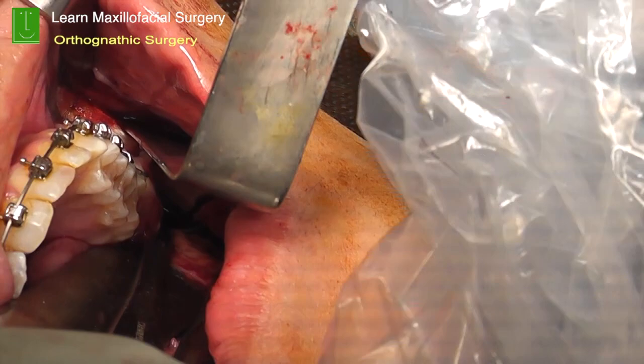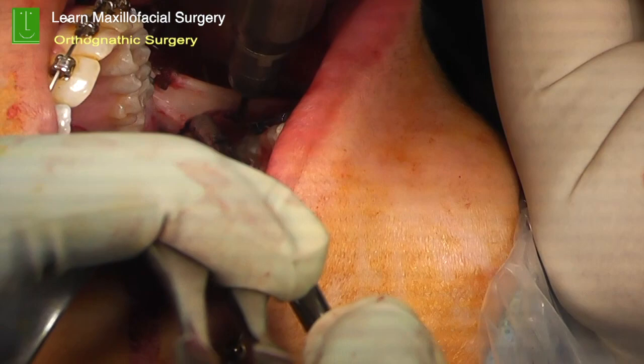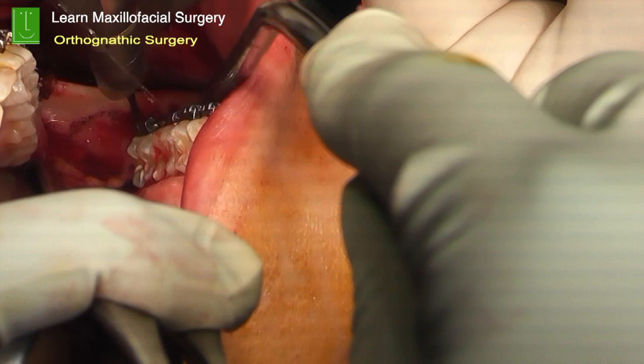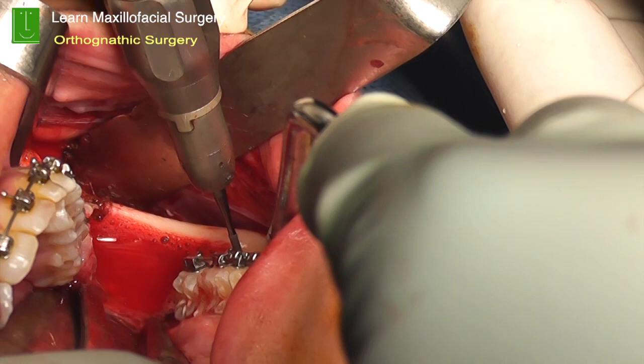So very gently, you don't have to really rush in at this point of time. Take your time. Absolutely important that you have a good thickness of bone even on the buccal side when you make your split. So don't make it very, very thick. It has to be ideal. It usually is only about 2 to 2.5 millimeters in thickness, the buccal bone. So it is important that you go between the buccal and the lingual plate. So that's where you're making your cuts there. That's completion of the vertical cut, right?